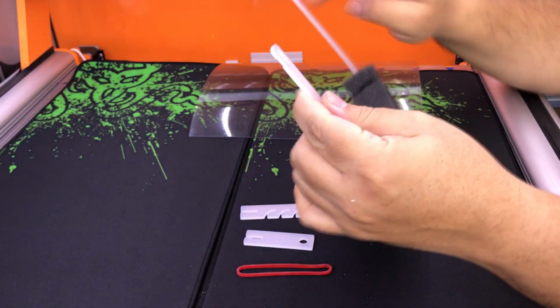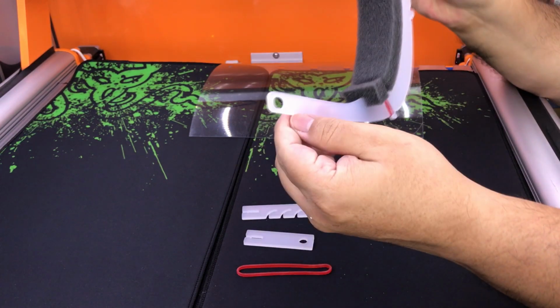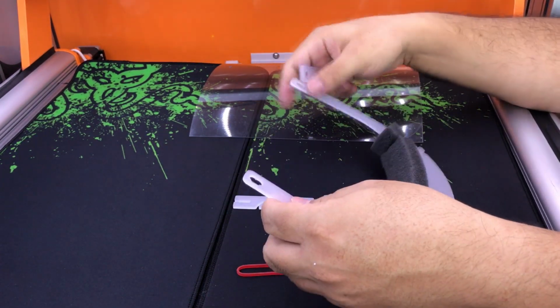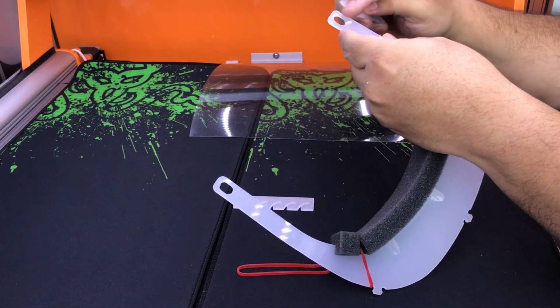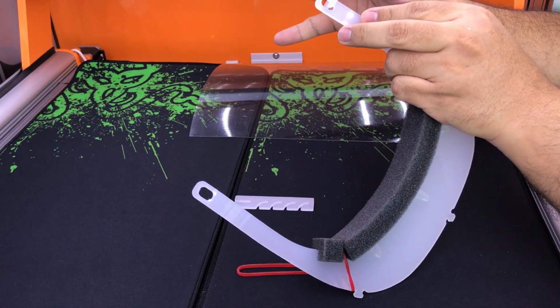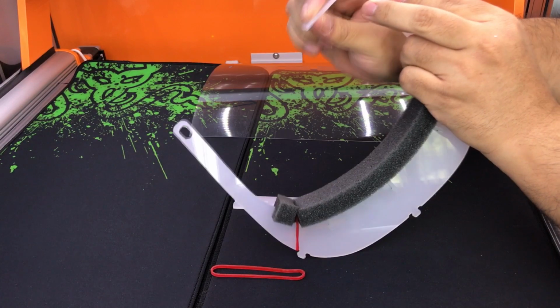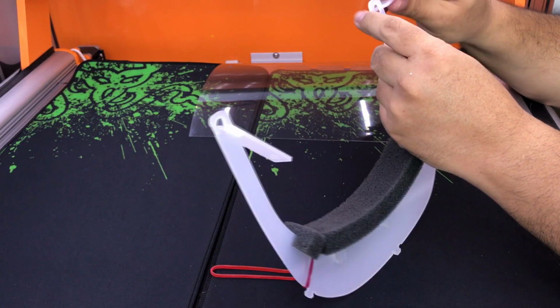Now the holding part here, you have two pockets, one here and one here. The pockets are on the outside of the mask to put these parts. So when you put one of the parts here, you have to put it from the opposite side like this, and it enters the pocket. Now because it's going to operate this side, it doesn't come out because it doesn't have the pocket on that side. And the other side, you do the same.